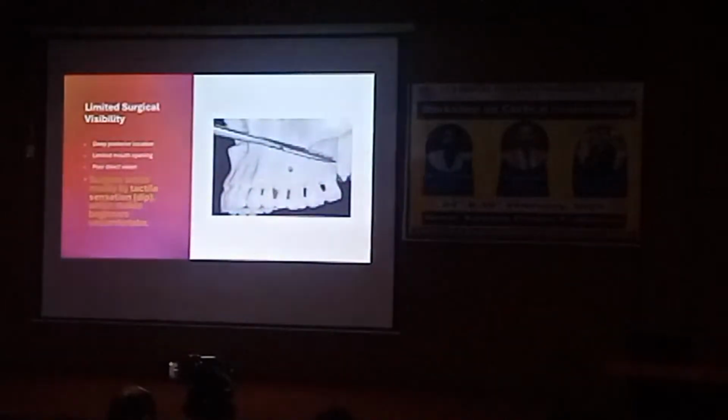A very similar dip to the root canal that we follow. So if you have found the pterygoid, when you are drilling, you will feel a dip, and that dip is the assurance point that you found the pterygoid and you are in the pterygoid. But I will teach you step by step how to find the pterygoid and where you will find the dip and how you will do a complete pterygoid engagement.